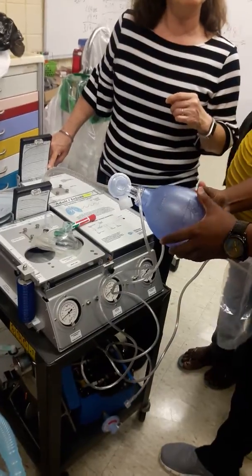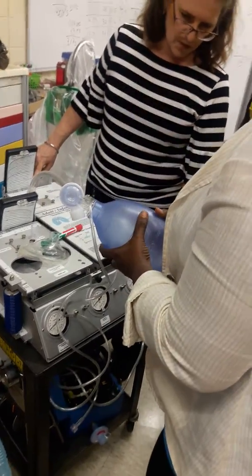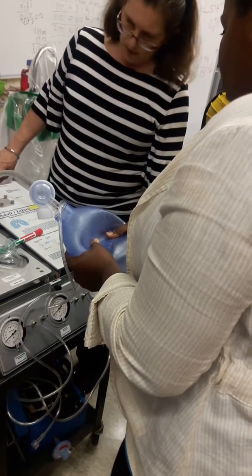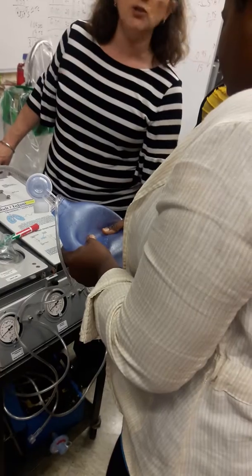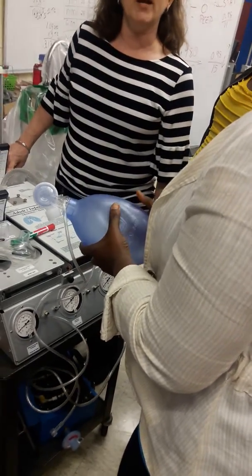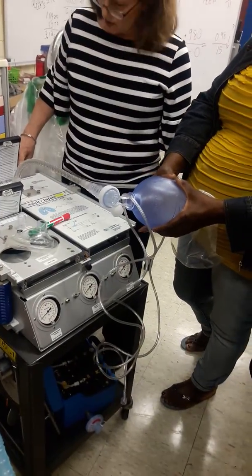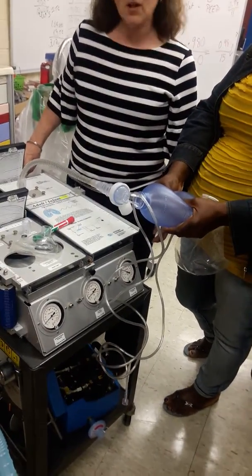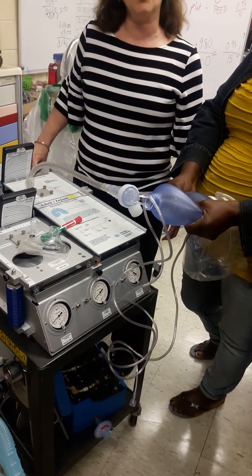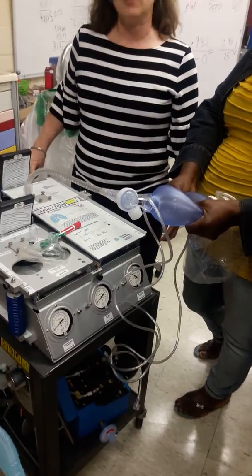Give it a squeeze. Hold the breath. There's your plateau pressure. So that's a less compliant lung. Compliance isn't swelling, because swelling occurs in your airways. What's that? Resistance. Okay.